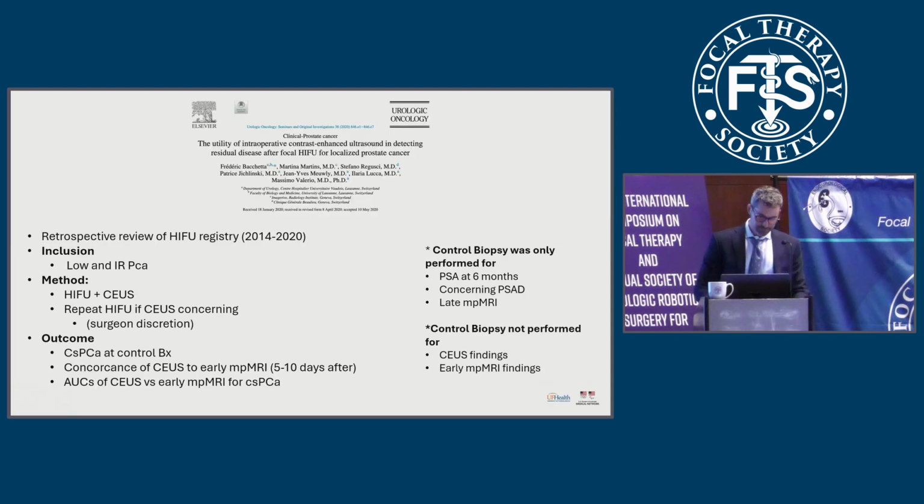Now, in terms of whether or not this changes management, Bacchetta in 2020 did a study where they performed HIFU and then they did a contrast-enhanced ultrasound. If the surgeon was concerned for whatever reason, he did HIFU again. Now, the outcome was clinically significant prostate cancer at controlled biopsy, and I'll explain what controlled biopsy means in a second. They also looked at concordance of contrast-enhanced ultrasound with an early multiparametric MRI at 5 to 10 days, and then saw, well, does it add value to any areas under the curve with other predictors of clinically significant prostate cancer in this patient population, which would be a concerning late multiparametric MRI, a concerning PSA density, and a PSA you're not happy with at 6 months.